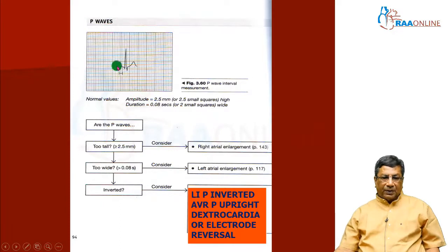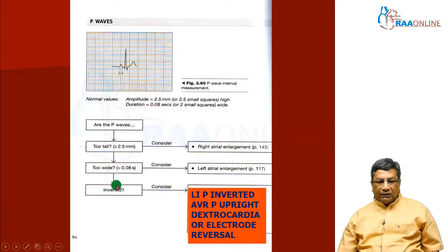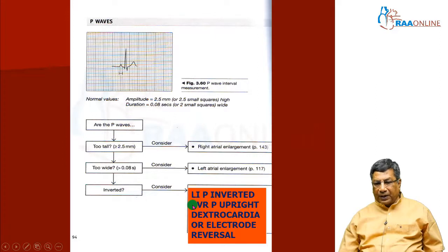We will start with the P wave. The P wave is due to atrial depolarization. When P waves are tall, it indicates right atrial enlargement. When P waves are wide, it indicates left atrial enlargement. When P waves are inverted in inferior leads, check where exactly they are inverted. If inverted in lead I and upright in AVR, suspect either dextrocardia or technical dextrocardia.